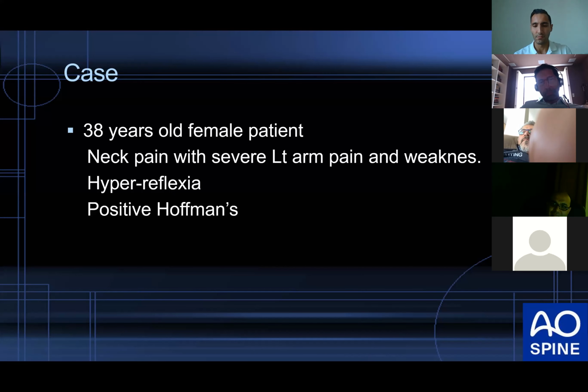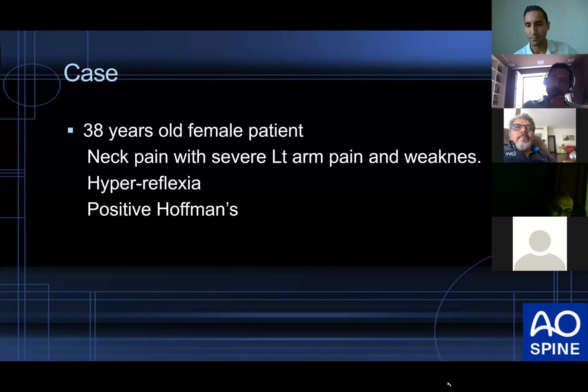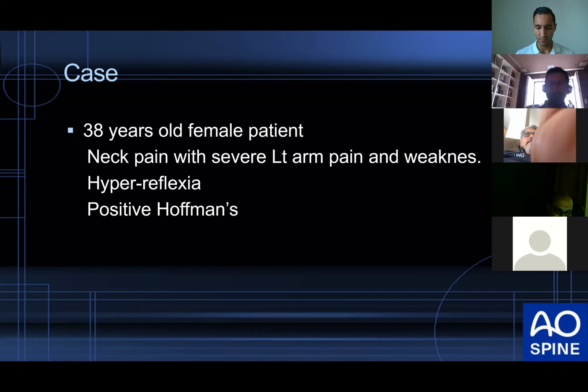And you also indicated it for some trauma cases, to decrease the motion, the instability, the hypermobility, which I think we cannot launch as an indication. I think trauma is a contraindication for total disc replacement as well. You need to stabilize, not to reduce the motion. You cannot guarantee the motion after total disc replacement.